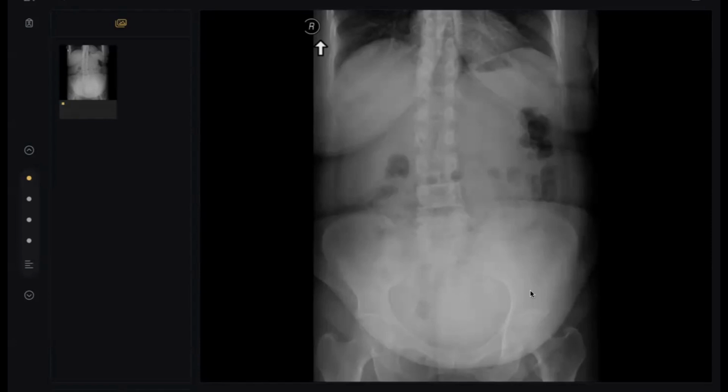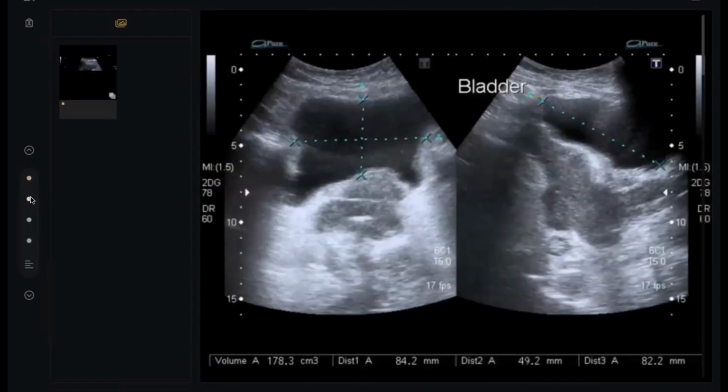Differentials for this could be lipoma. Are you sure, doctor, this could be lipoma? Other differentials in this case, it could be a soft tissue lesion seen within the pelvis. So don't restrict yourself, whatever it will be, for further characterization. Sure. I'd like to compare with previous imaging, and if there is no previous imaging, I'd like to proceed with initially a CT of the abdomen and pelvis with contrast. CT? No, ultrasound first. Sorry, yes, gynae. Ultrasound.